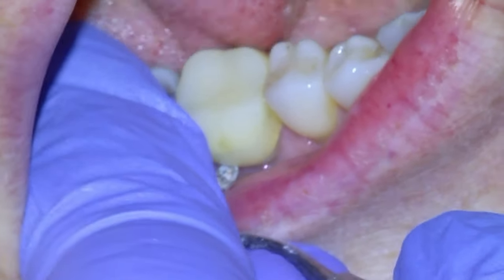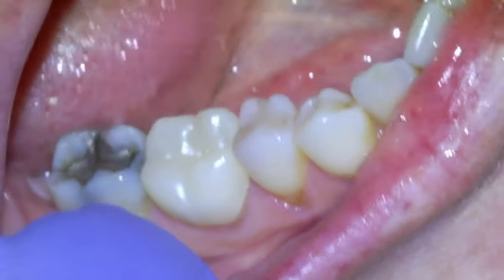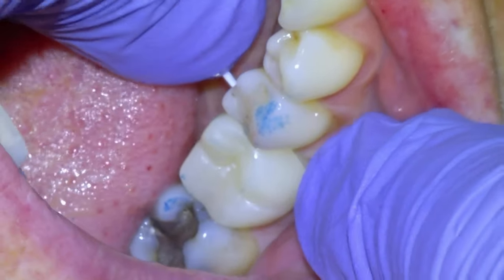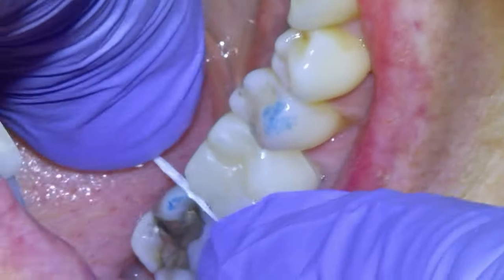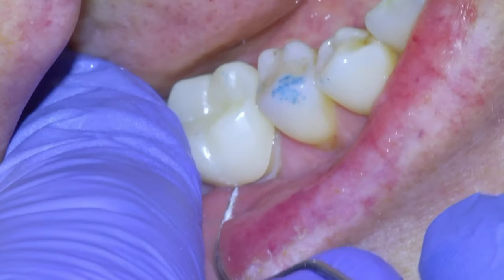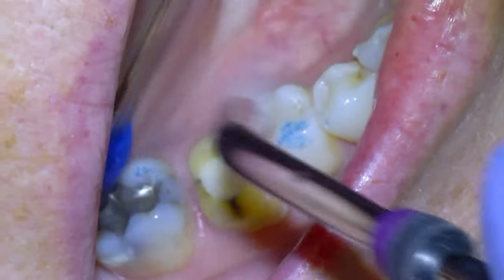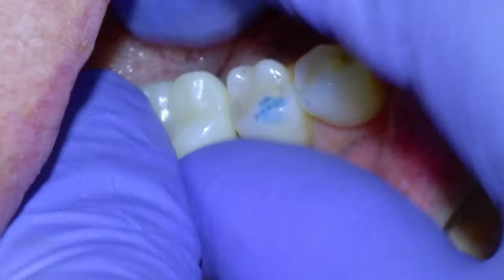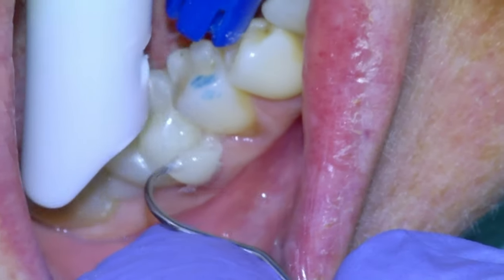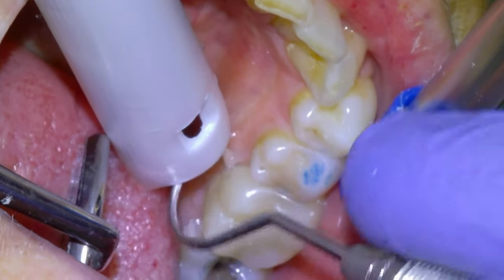Then we'll get the patient back the next week, flick the temporary off with a spoon, clean up the excess temp cement, and do a dry fit. Check with the bite, make sure it feels comfortable — which it did, didn't have to make any adjustments. Check the interproximal contacts — we're happy. Then we'll remove the crown and treat the intaglio and pumice the prep. Thorough rinse and dry, then Jackie is going to load up the crown and we're going to seat it with Panavia SA self-adhesive cement. Once we clean up the temp cement, the patient's good to go and this tooth will be back in service.